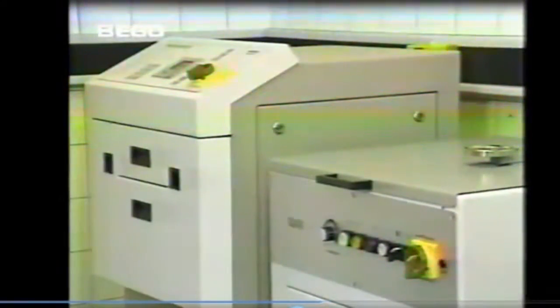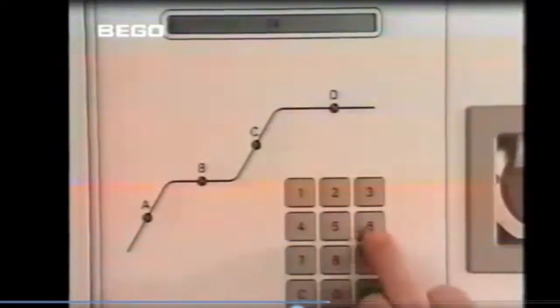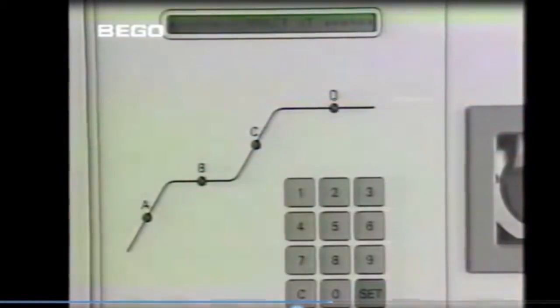Ongoing development of the casting technique led to the microprocessor-controlled high-frequency vacuum pressure casting machine in the form of the Nautilus MP. The casting program for a specific alloy, Wironit extra hard, is being loaded here. Preheating is used with this casting technique as well in order to heat all of the ingots evenly.